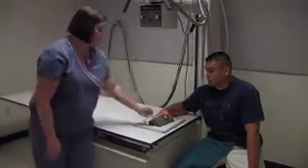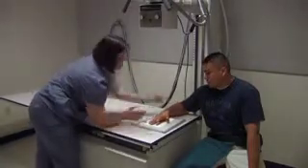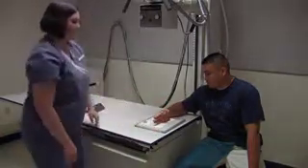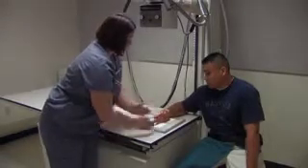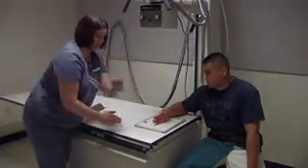Next projection, it's a lateral, which is all the way up and down, 90 degrees from the PA. Sir, can you karate chop the board for me, please? Hand in the center of the film. Very good. Bring your thumb down next to your hand. You want to make sure Ramon's got a nice straight hand, which is good. You want to not have a cupping effect, which is when they cup their hand. You want it nice and straight. Good.